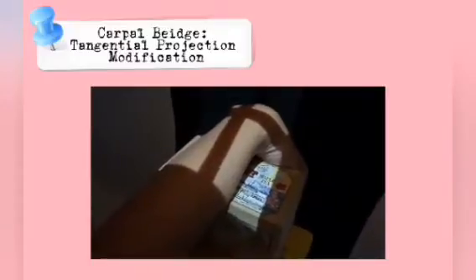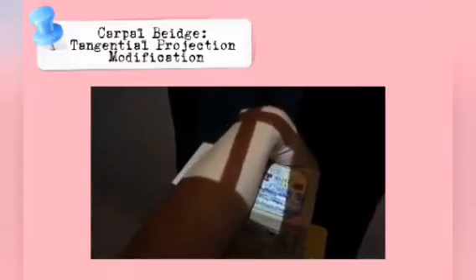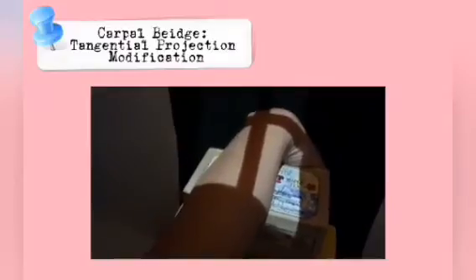Central ray. Directed to a point about 1 1/2 inches or 3.8 centimeters proximal to the wrist joint at a caudal angle of 45 degrees. Tina, and I am going to demonstrate the first carpometacarpal joint, AP projection, Robert method, and in wrist in the scaphoid series, PA axial projection, Stecher method.